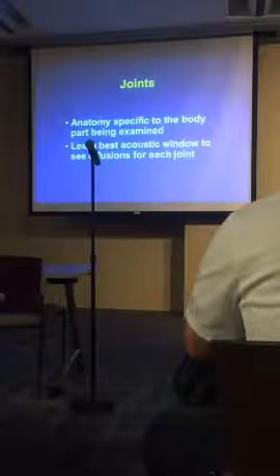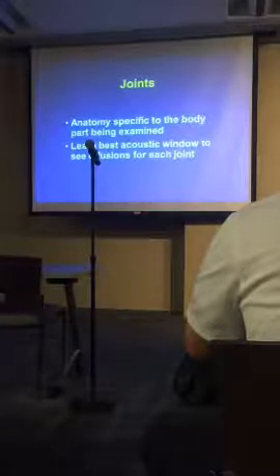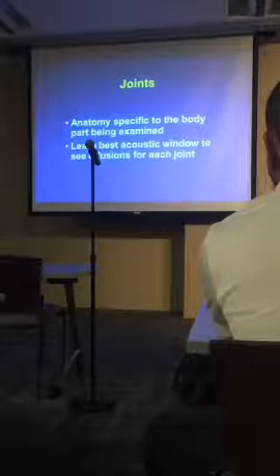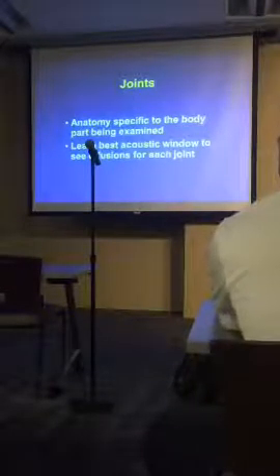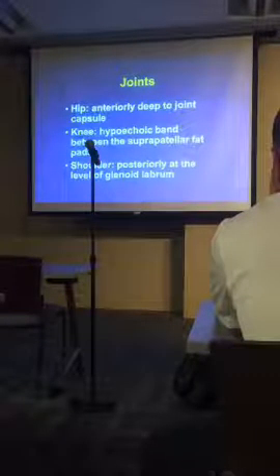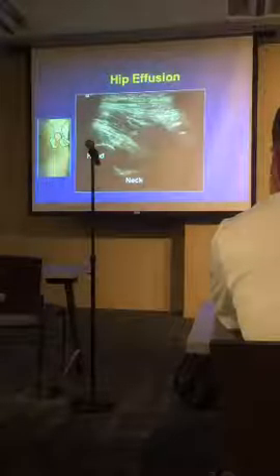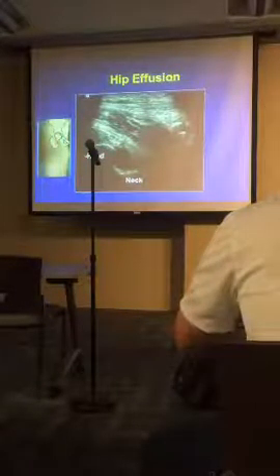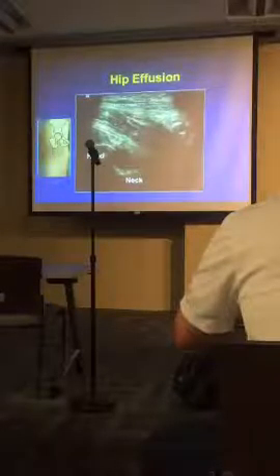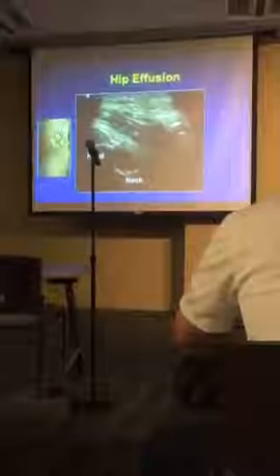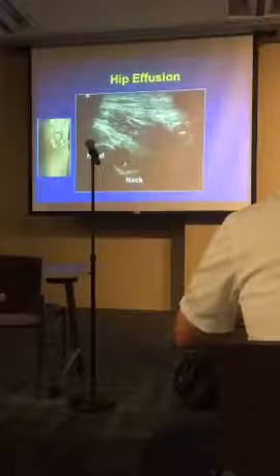Moving from tendons to joints: the anatomy is specific to each body part, and you learn the best window to see effusions for each joint. For the hip, we place the probe longitudinally to see the femoral head and femoral neck. Effusions gather at the head-neck junction, where the capsule is most loosely applied. Here is an effusion at the head-neck junction.